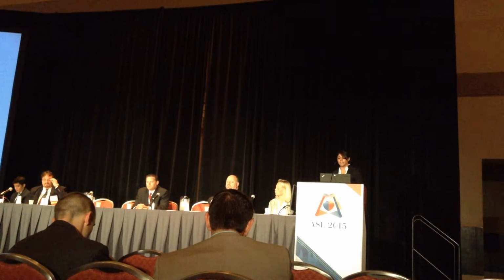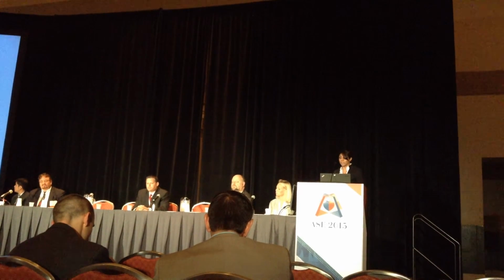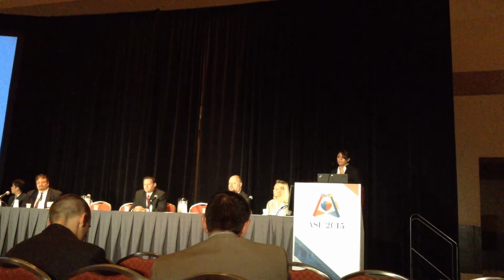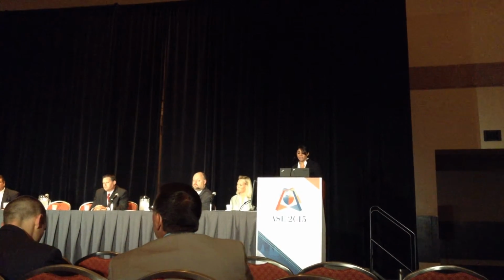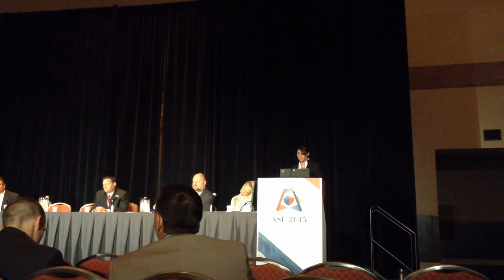So this is an example of a 3D data set, and it looks at multiplane reconstruction, and it's an off-axis transthoracic view. And as I mentioned earlier, if you perform an off-axis view in 2D, this may overestimate the valve area. So with 3D, if we can use multiplane reconstruction, we can align all these scan lines right at the tip of that mitral valve, so we can accurately assess the mitral valve area by planimetry. So we're just moving these scan lines, so we're not at the body or the base of the valve, we're right at the leaflet tips.